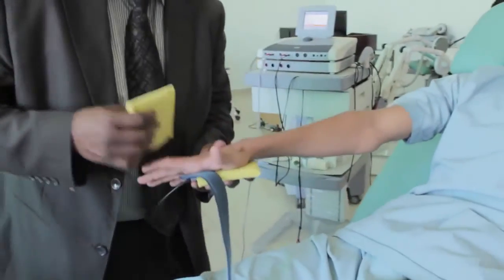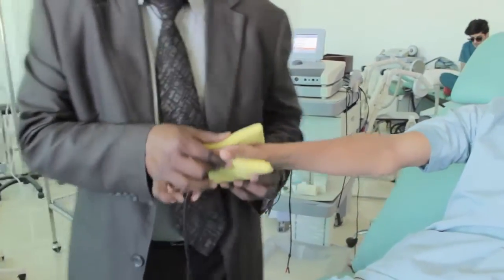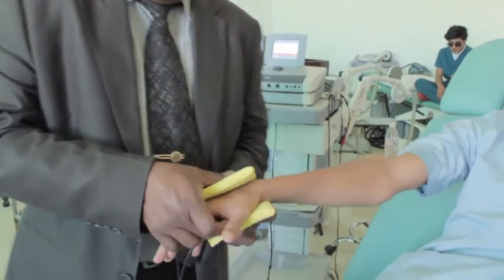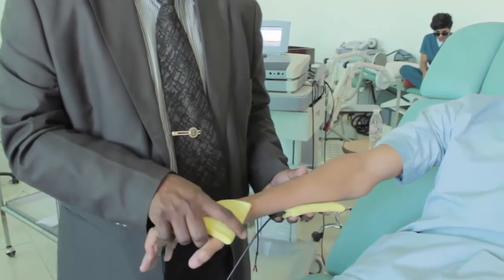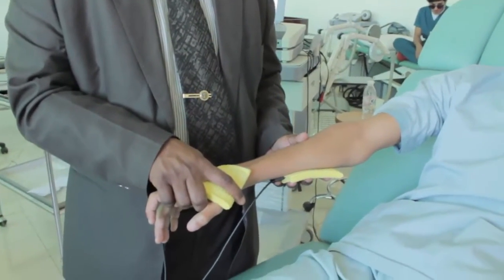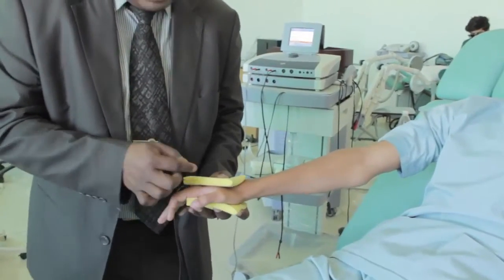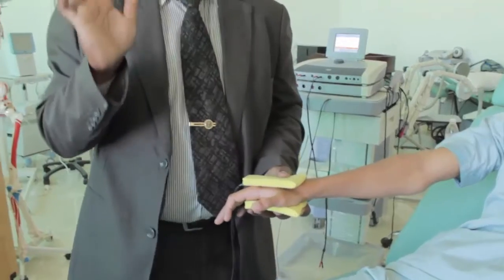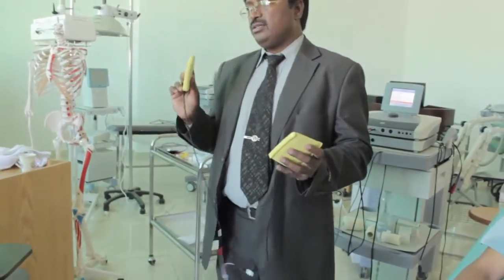Okay? For example, in the hand, if I keep like this and if I keep like this and they touch, it is too narrow. So that is the time I keep on the muscle and I keep a little far. Because when they are near, the electric current will pass from electrode to electrode, not through the body. We want the electrical current to pass through the body.